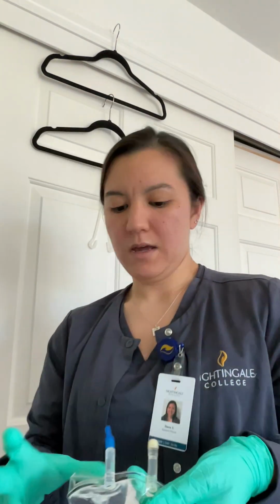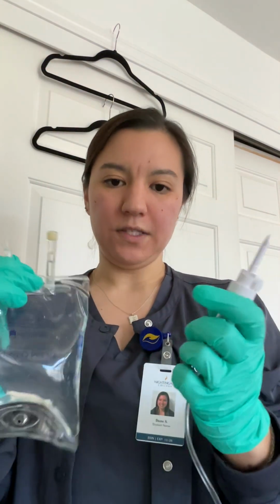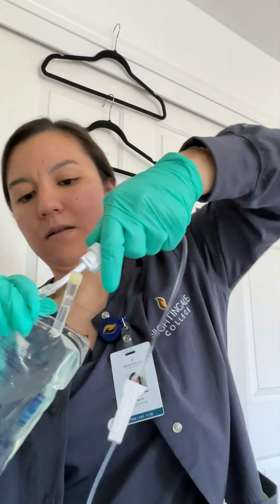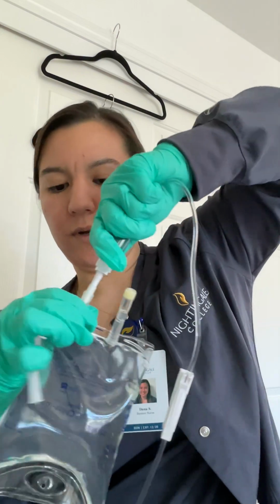All right. So I'm going to go ahead and start with my normal saline. I'm going to take off the cover of the spike, and we're going to spike the bag, pushing it all the way through.